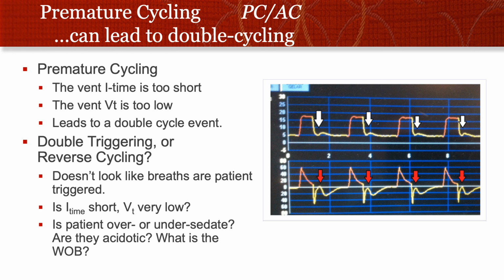If they're very sleepy with bigger tidal volumes or higher PEEP, in this case it's just 5, but if we were at a PEEP of 10 or 12, I would worry a little bit more about reverse cycling, but I can't tell in this picture here.